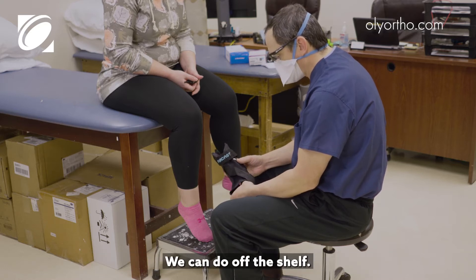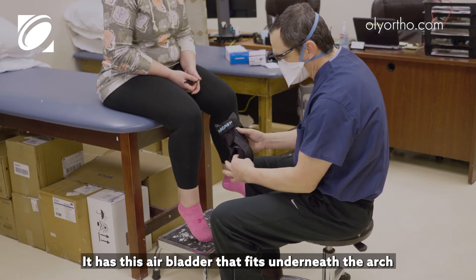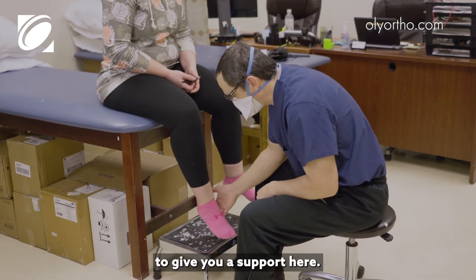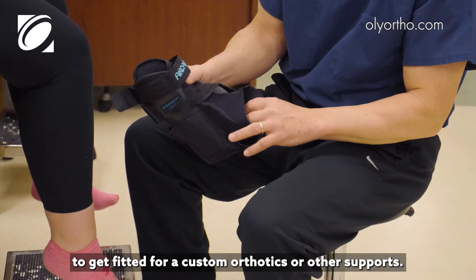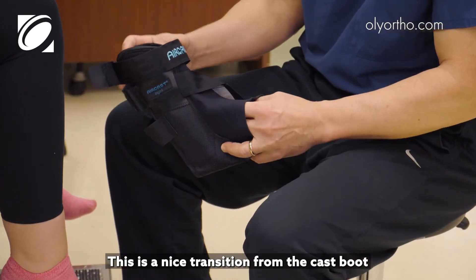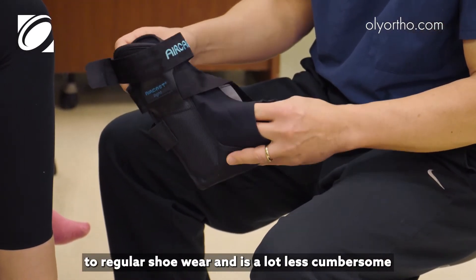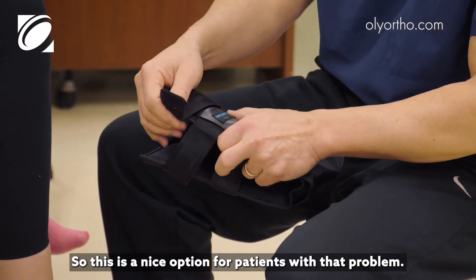This brace is nice to use and can be done off the shelf. It has an air bladder that fits underneath the arch to give support, so this can provide good relief while waiting to get fitted for custom orthotics or other supports. It's also a nice transition from the cast boot to regular shoe wear and is a lot less cumbersome than the boot.